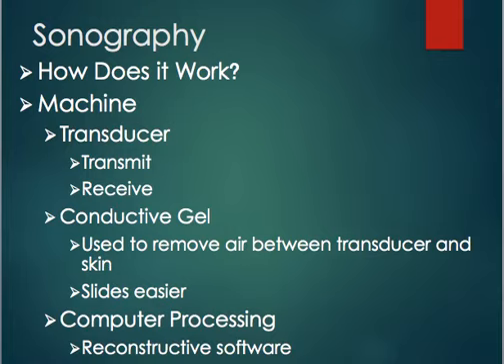So the ultrasound process involves placing a device called a transducer against the skin of the patient in the area of interest, so wherever we're trying to scan. The transducer has what's called piezoelectric crystals inside of it. So what happens is an electrical current is applied to the crystals inside, and then the crystals will vibrate or change shape. And as they do that, they'll produce sound waves.